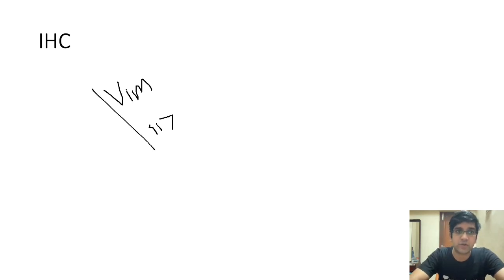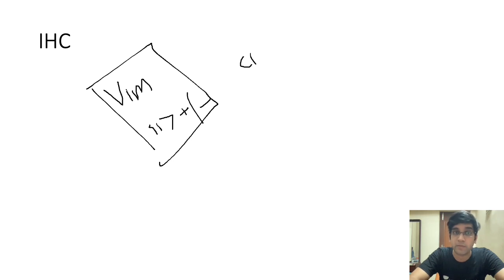It's more of a histological diagnosis where a little bit of vimentin and CD117 plus or minus, again since it's focal, cytokeratin will be positive as I said in the pleuropulmonary blastoma, in the epithelial component alone, fine? EMA should generally be negative. And as I said, myogenin will be negative in the blastemal cells. If there is rhabdomyoblastic morphology, please mark the areas and look for them in myogenin, they'll be positive. A very focal rhabdomyoblastic morphology in an entirely primitive lesion still goes with pleuropulmonary blastoma with a rhabdoid differentiation maybe. It's not an embryonal rhabdomyosarcoma, because in embryonal RMS, every tumor cell should be positive for myogenin or myoD1. Fine. Okay.